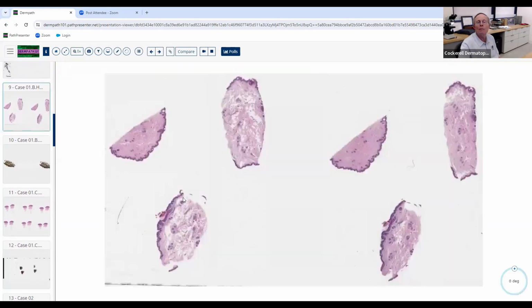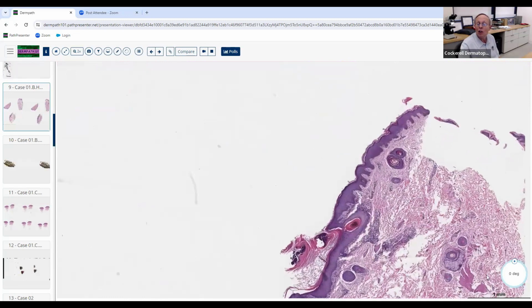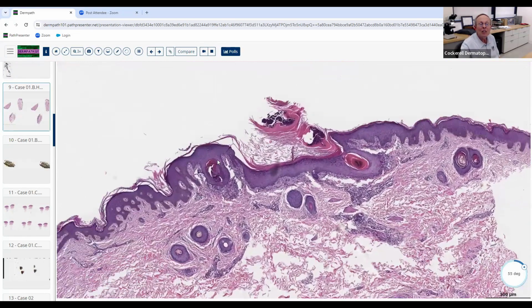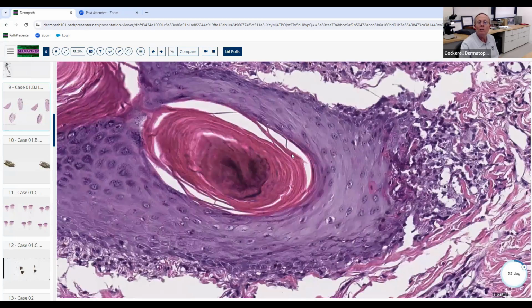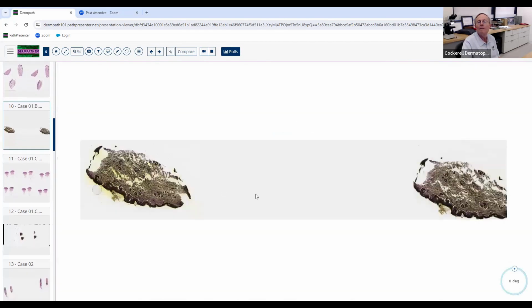So we have a couple of other examples. This one's not quite as good because we had to cut deepers and most of it went away, but it's the same basic process here. You've got these follicles that have got neutrophils and degenerated collagen or elastin or both being transepidermally eliminated. So the host is just saying it's almost like a splinter. It's like there's foreign material. Let's get rid of it. So it goes out the epidermis. Patients pick at it, scratch at it, gradually goes away.